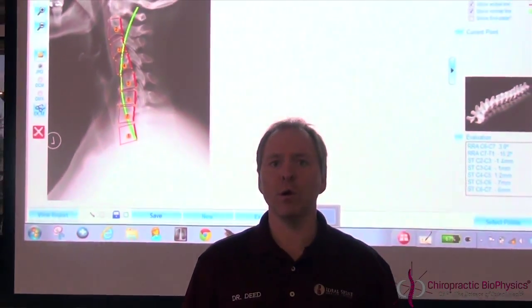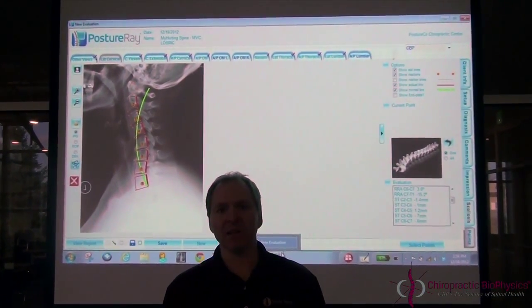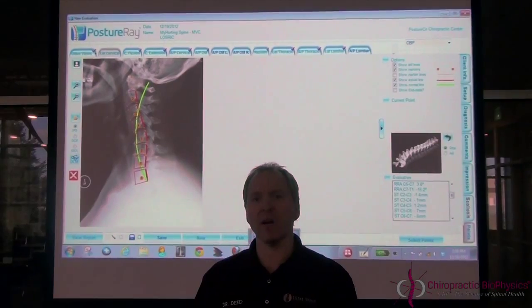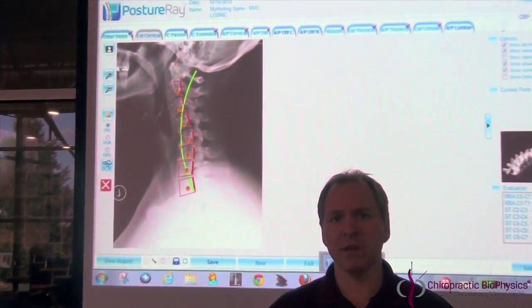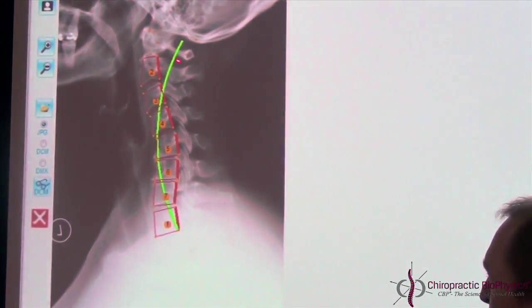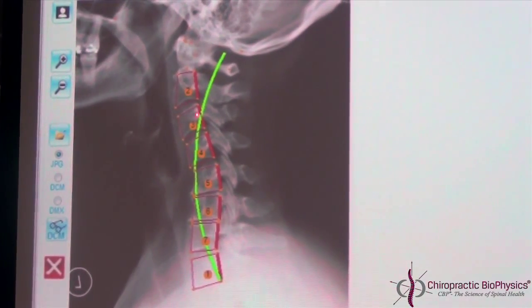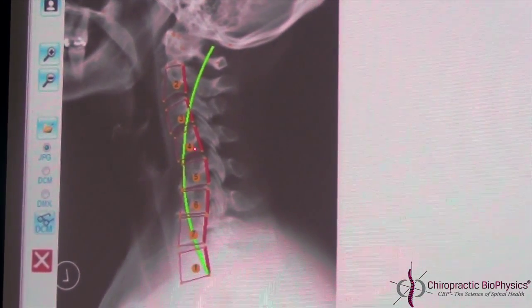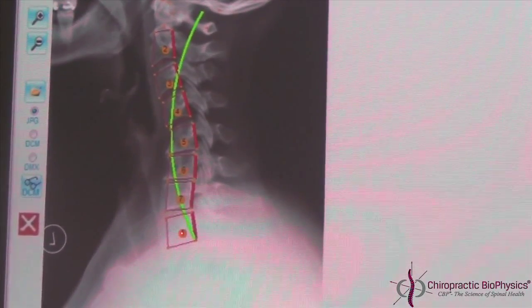Showing in the backdrop behind me is a lateral view of the cervical spine, and we're showing the analysis in the doctor's analysis template — not the patient report. You'll see we're able to put a geometric shape like a rectangle or pseudo square around each vertebra because we've digitized the four vertebral body corners.